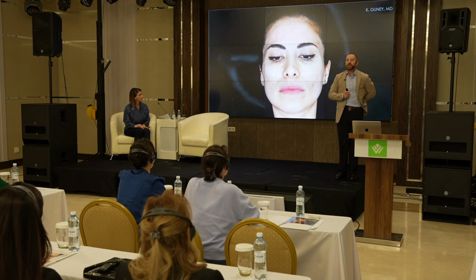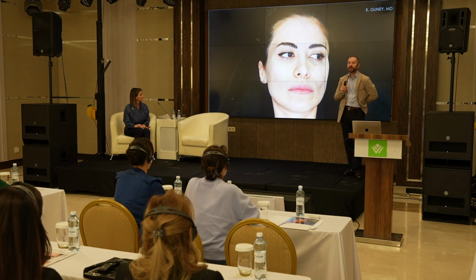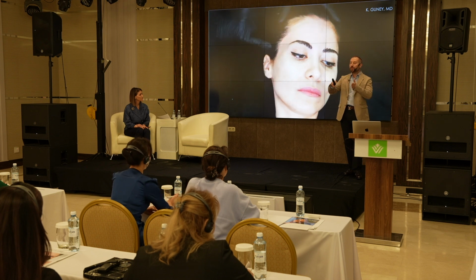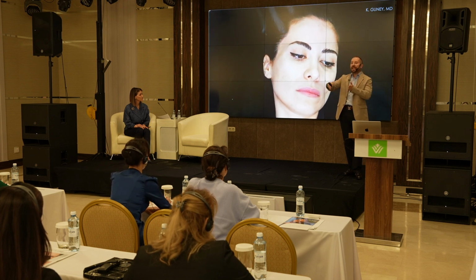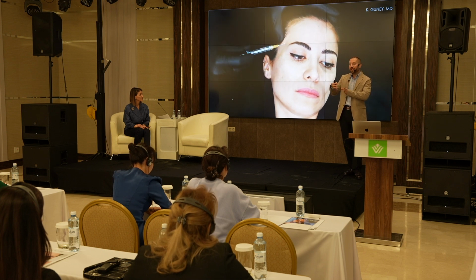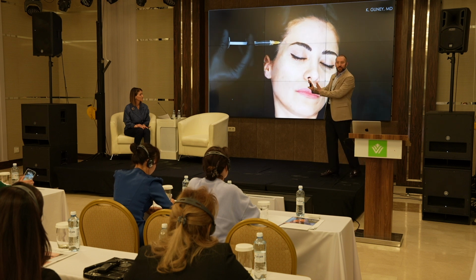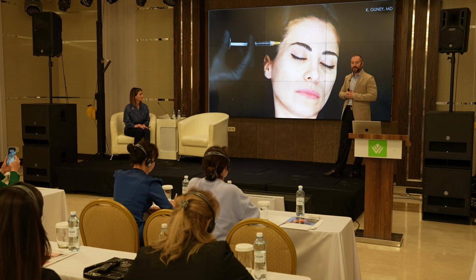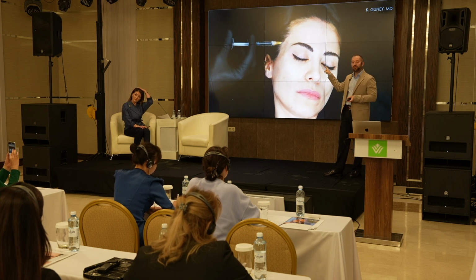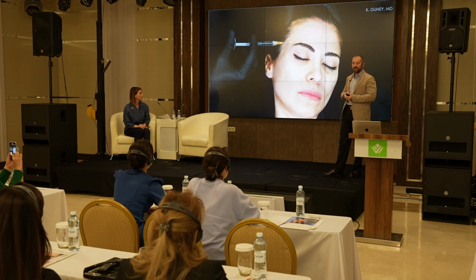And I will show you the gunshot technique here. And of course, the product should be ultra deep. Why? I told you it has too much tissue, many layers. That's why if we inject deep, I need a high G prime product to give volume from the deep to the tissues. Touch the bone, bevel down, then I inject really slow injections, low pressure injections, ultra deep in the gunshot.